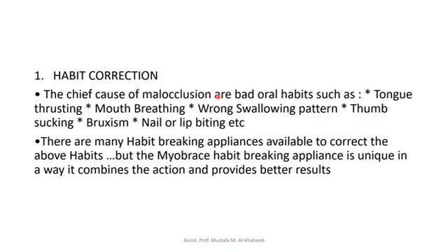The concept or the procedures for Myobrace treatment, as a summary: first is habit correction. The chief causes of malocclusion are bad oral habits such as tongue thrusting, mouth breathing, swallowing pattern, thumb sucking, bruxism, nail or lip biting, etc.